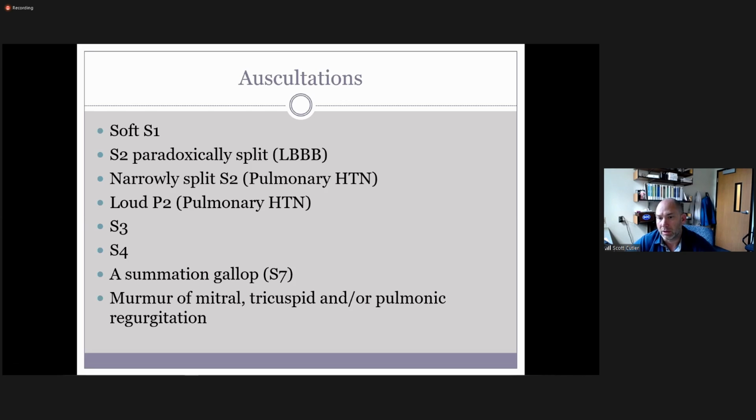So that's actually pretty good. A good echo tech is going to be between 20 and 30 minutes on pretty normal studies. They might take a little bit longer with an abnormal study. But yeah, our time will certainly get down to there. And most labs schedule their patients for an hour. So you actually do have a fair amount of time. So once you get good at scanning, yes, you'll have more time to do that, and do it in conjunction with your doctor.